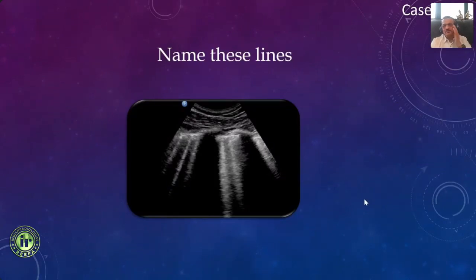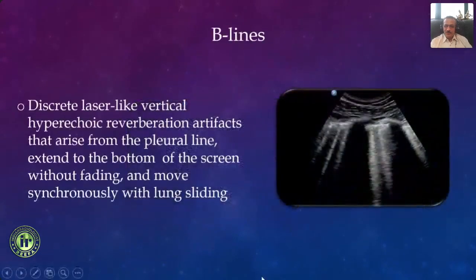Case number 11. This is again very easy. So the answer is found, sir. Good. Someone wrote Venetian, but B lines is what Sucheta Umbarkar has written. Very good, Suchita. Yeah. So now we have to be very familiar with this in this COVID era, and we'll see how.